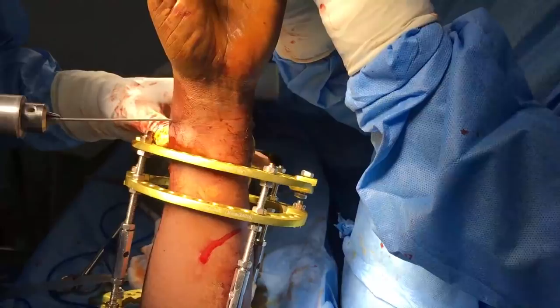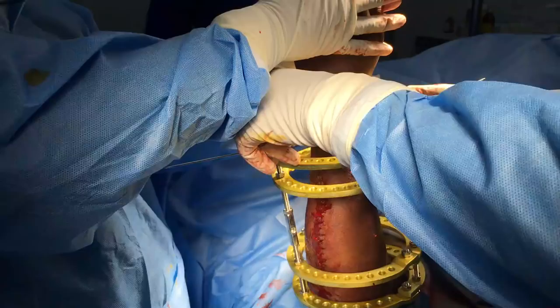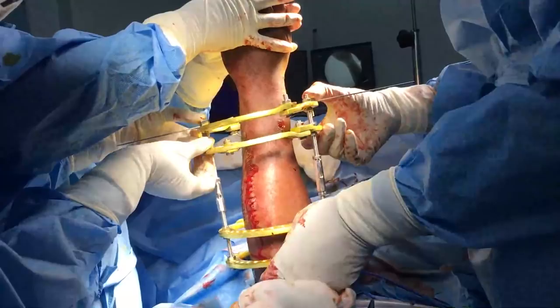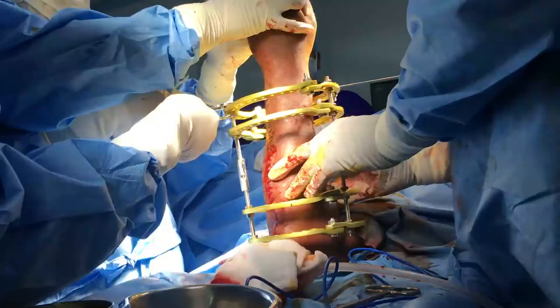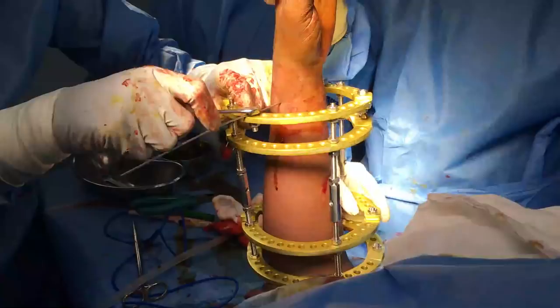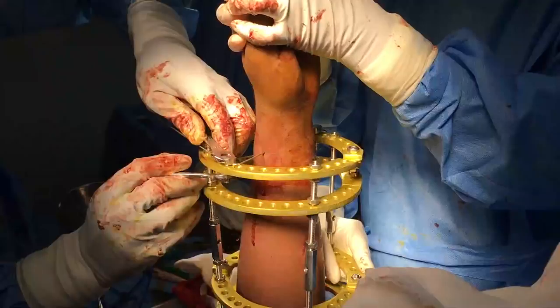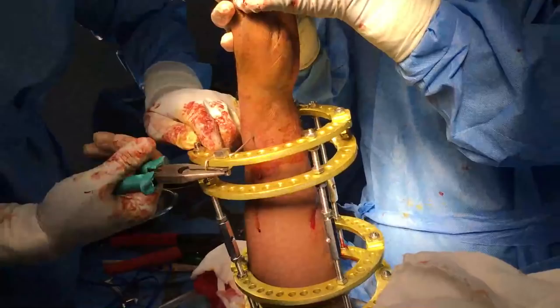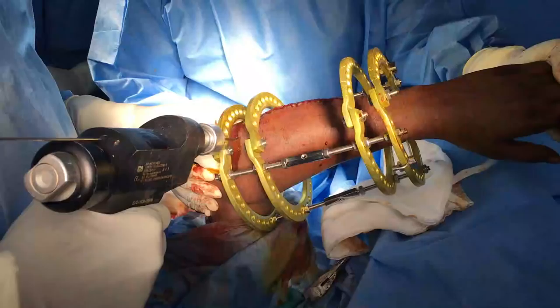The wire is passed slowly and advanced periodically. One end of the wire is tightened and the opposite end is tensioned by twisting the nut by 90 degrees, stretching the wire by winding it around its shaft. This is called the Russian method. The wire ends are cut close and twisted tight.